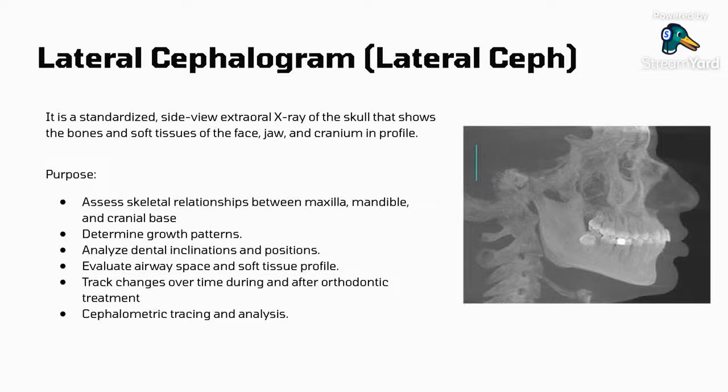And then it is to track the changes over time during and after orthodontic treatment using the landmarks for precise measurements. Then lastly, the cephalometric tracing analysis is the most critical diagnostic tool used in the orthodontic diagnosis.